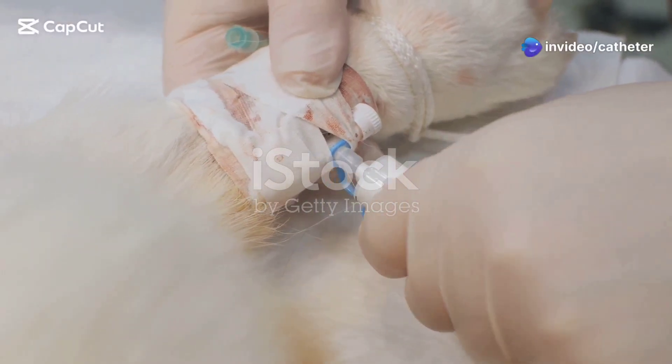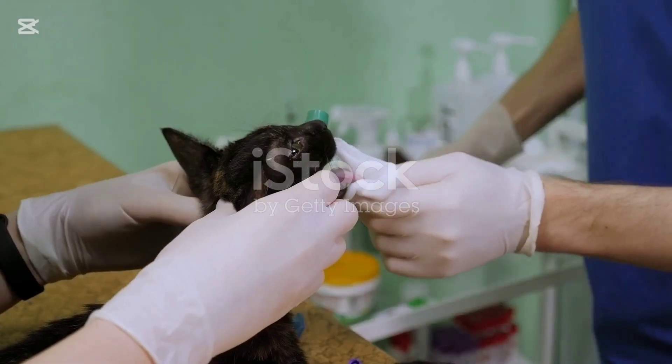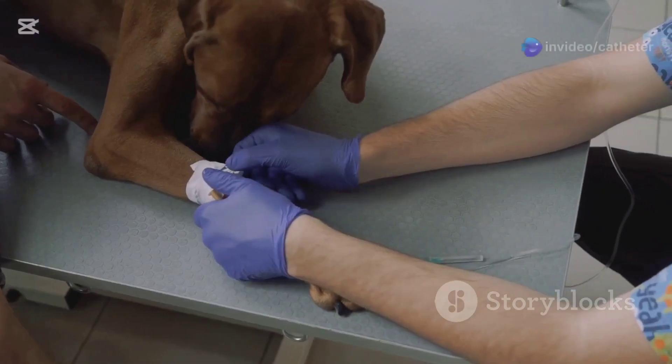Welcome into the essential skill of IV catheter placement in animals. Whether you're prepping for an exam or getting ready for clinical rotations, mastering this technique is a must. So let's get started.